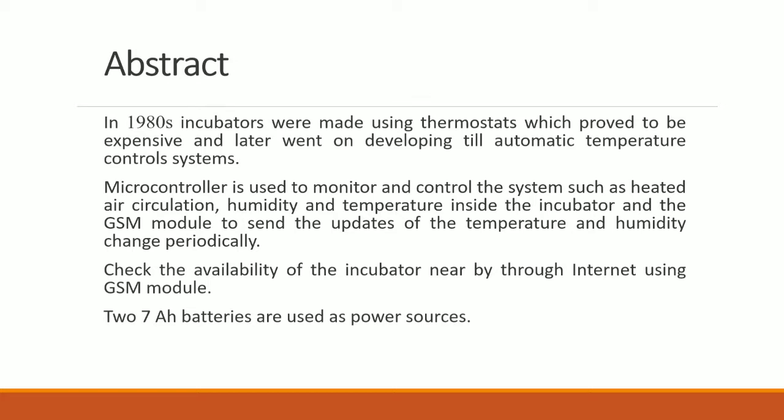Here we are using a microcontroller, and as input to this microcontroller we are using sensors. One is LM35, then DS18B20, DHT11 and FSR. FSR is a force sensitive resistor. Both the DHT11 and DS18B20 are controlled by the microcontroller to produce an output, and this output is displayed on an LCD screen. We use a GSM module here, and we use two 7Ah batteries. One is for the microcontroller and the other one is for the heating element. Next.